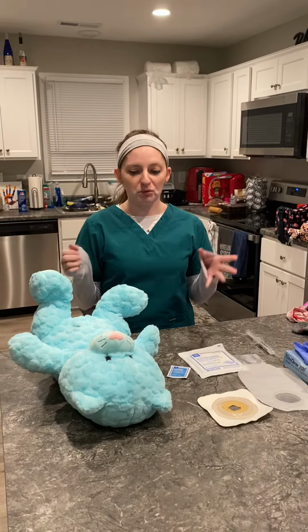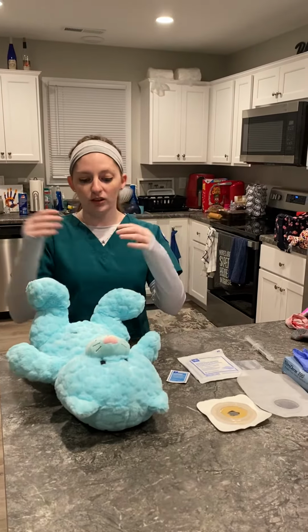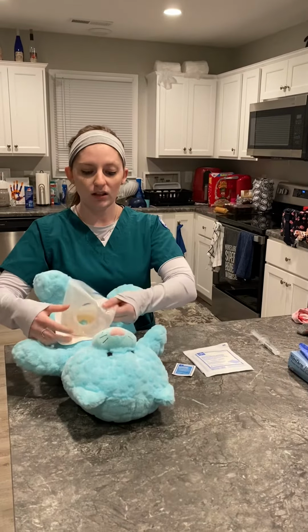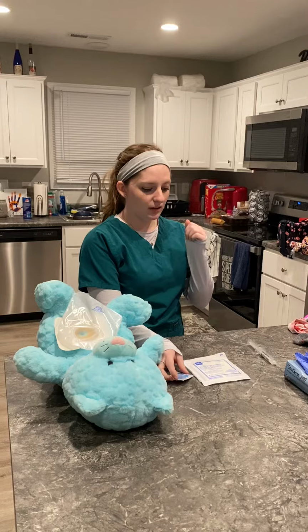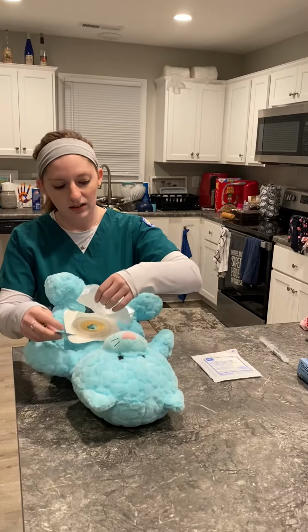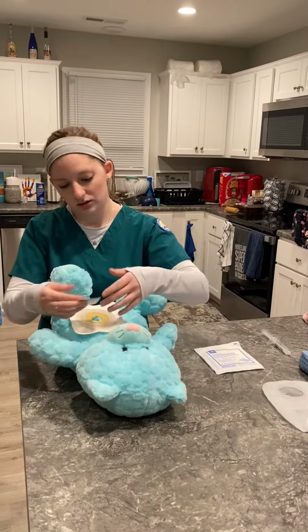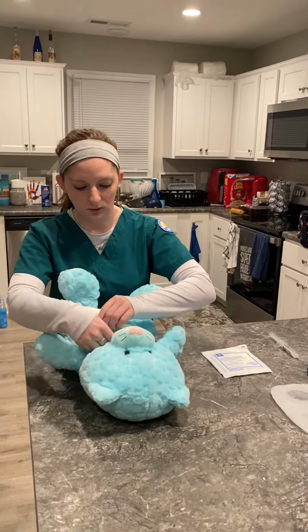So first off, I'm going to make sure my patient's in a comfortable position. I would already have one on my patient, so I'm making sure I need to change it. So when removing the bag, we'll use a special protective wipe because it's a very sensitive area. And you take this off.